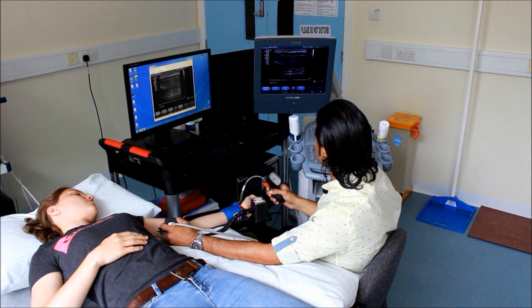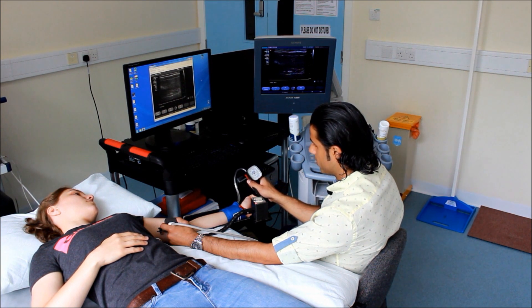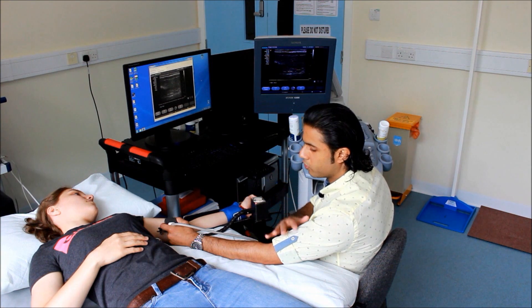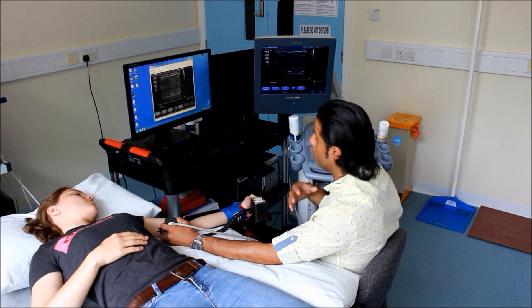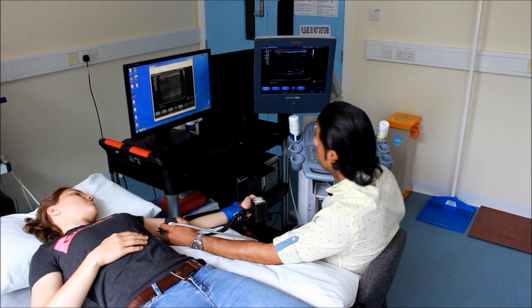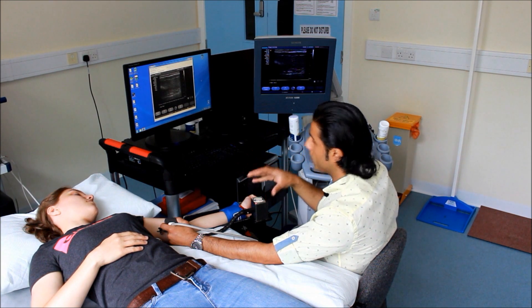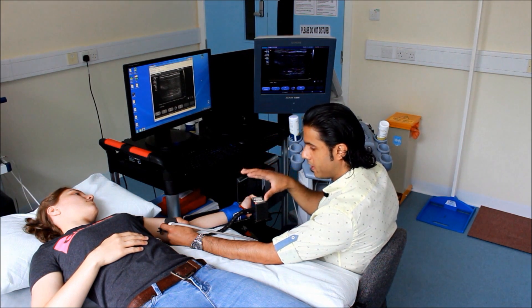After the five minutes, when we release the blood pressure cuff, there's going to be a sudden increase in blood flow through the artery which the ultrasound probe will detect. That sudden increase in blood flow is going to exert shear stress on the brachial artery, on the endothelial cells, which will cause the release of nitric oxide and then we'll get vasodilation. During this phase, make sure you've got a very nice clear image and monitor the blood pressure because with this pressure cuff you can sometimes get leakage of air. Make sure your arm is comfortable, your back is supported, your arm is supported by the pillow, and keep steady pressure on your hand so movement stays nice and secure.